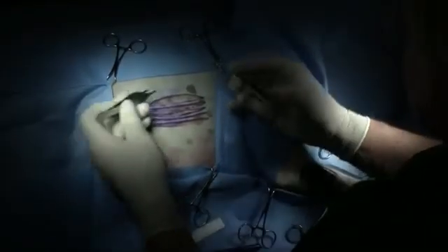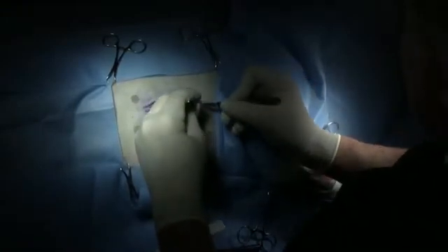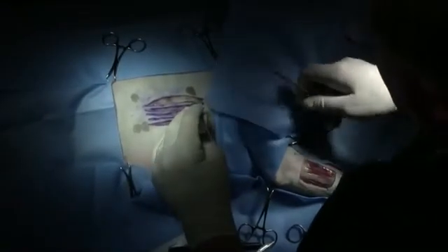What we'll do is leave one end of that graft attached. We go to the other end and we cut it loose with the scalpel blade. Now a graft has to be dermis and epidermis only. You don't want any subcutaneous tissue on any graft, and strip grafts are no exception. So we need to get the subcutaneous tissue off of this graft. If you have subcutaneous tissue on that, it impairs the ingrowth of blood vessels into the dermis of that graft.